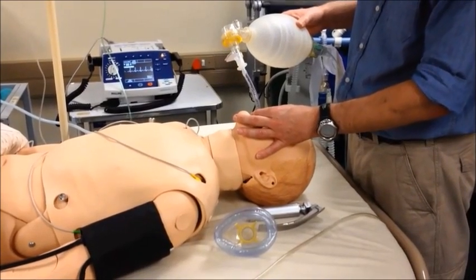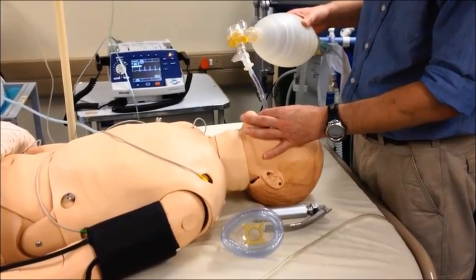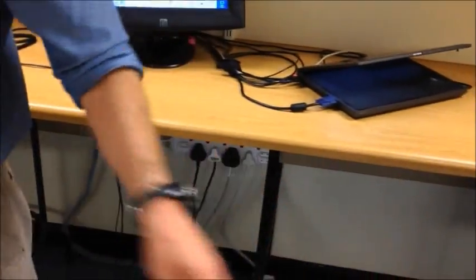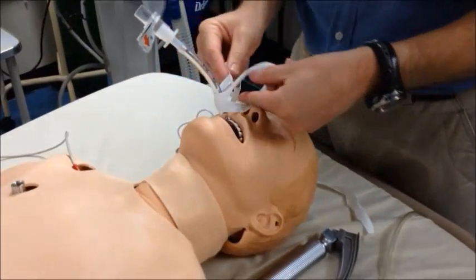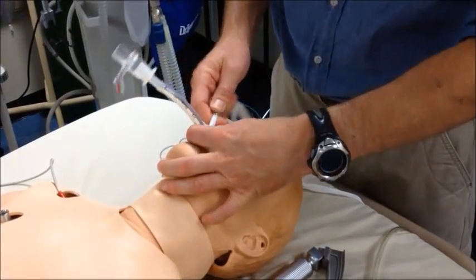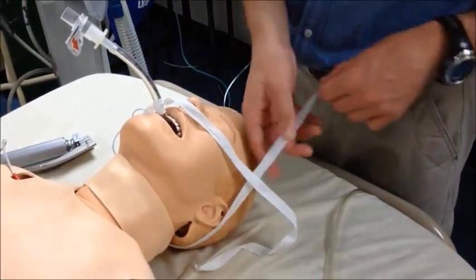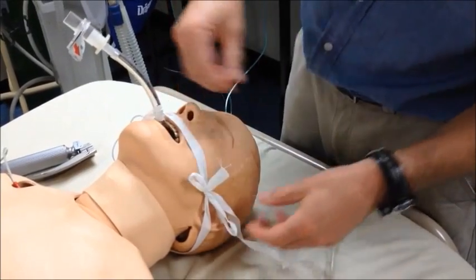I will now demonstrate one technique using a piece of tape that you tie in a specific way. For the purposes of this demonstration, I will remove the ventilation device from the patient's tube — in real life you would not do so, but continue ventilations throughout. Cut a standard piece of tape about a meter to a meter and a half long, then cut it slightly lopsided in length. Put the loop around and feed through itself. Seat it at the depth and tighten it around the tube to make sure that it is secure. You should now be left with a short end and a long end. Pass the long end of the tape underneath the patient's neck and tie a simple bow knot on the side of the patient's face. The tube is now held secure.